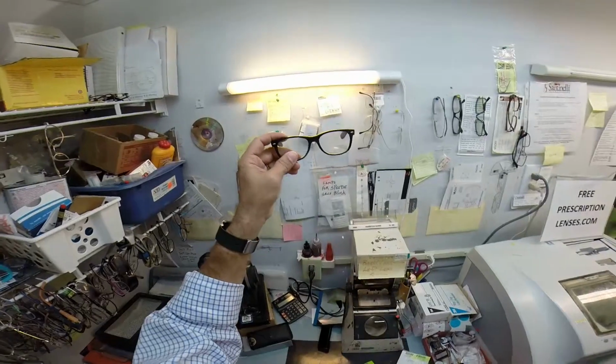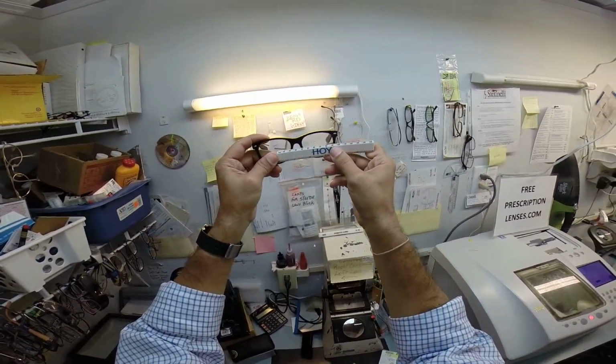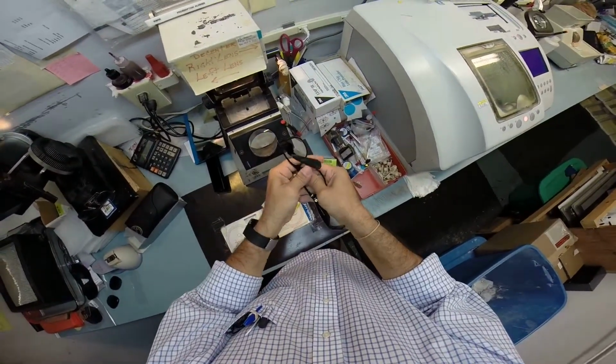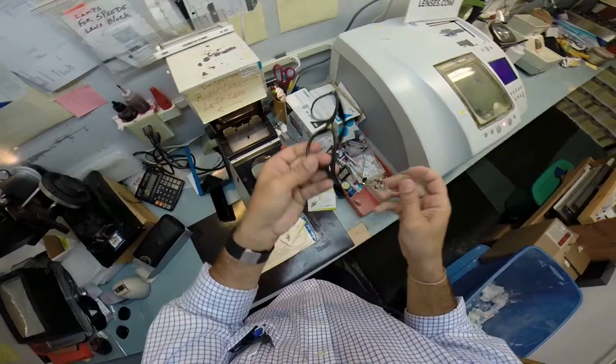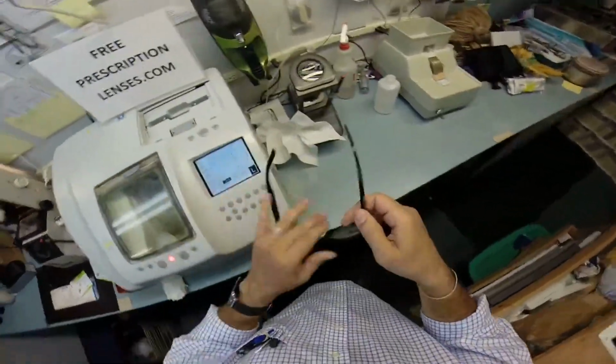And I just want to do one quick measurement. Oops, let's hold this up right side. We are good to go. So I'm going to test that other lens, but one thumb on top of the other, push down, out it comes. Flip the frame back over, tuck it in the outside corner, push down, we're good to go.